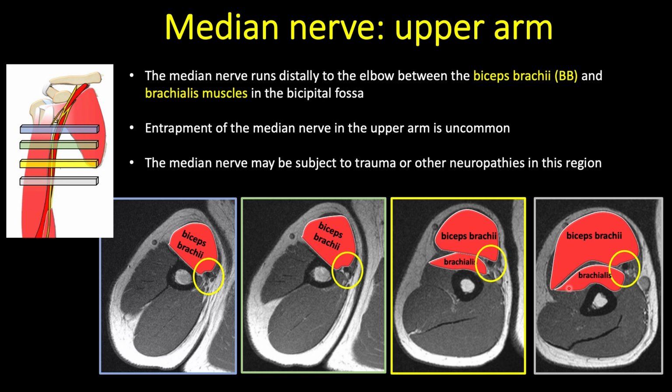Entrapment at these sites is quite uncommon, but of course the median nerve may be subject to trauma or other neuropathies in this region. And now we move to the live ultrasound of the median nerve at the upper arm that will be performed by Dr. Albano.